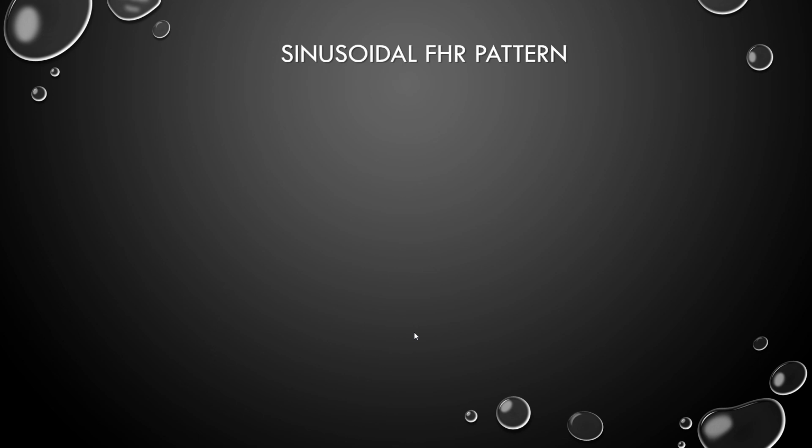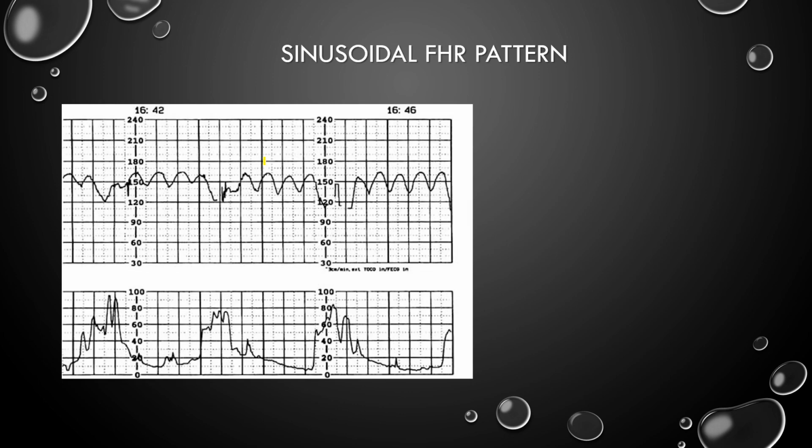So now I talked to you earlier about the sinusoidal fetal heart rate pattern. Now we're going to talk about what that means. We're going to bring back some math and some trigonometry and talk about the sinusoidal wave, or the sine wave, sin for sine. And look at how it goes up and down, up and down, up and down. This is called the sine wave pattern. And you can tell that you're getting deceleration, acceleration, deceleration, acceleration. If you have this and you have these strong uterine contractions, you can tell that there's some kind of sinusoidal pattern going on, and this is very problematic and harmful to the baby.